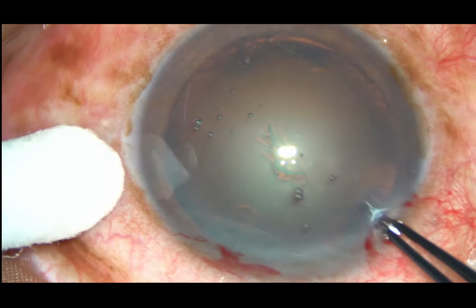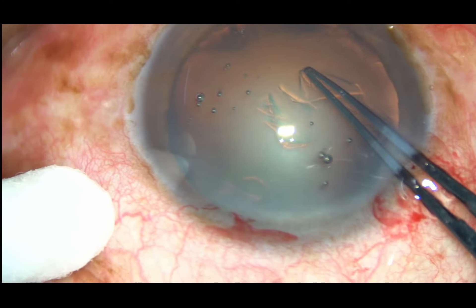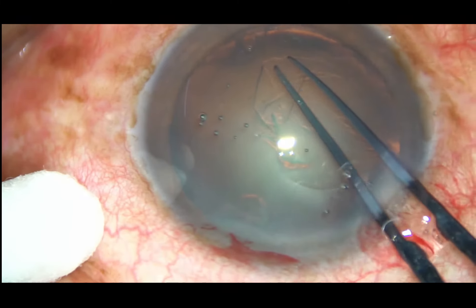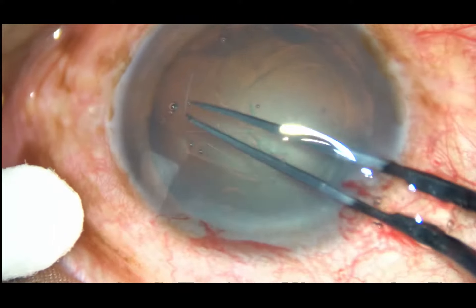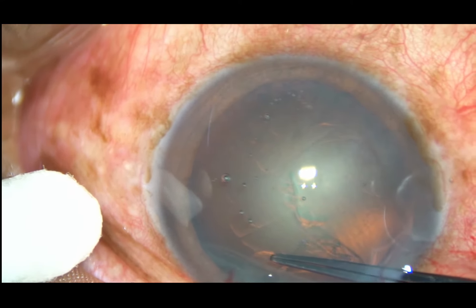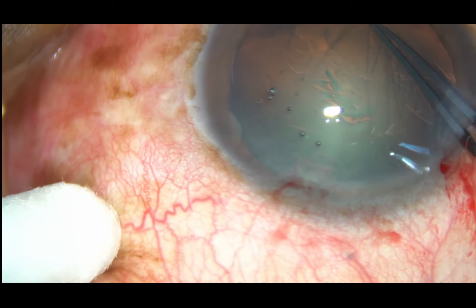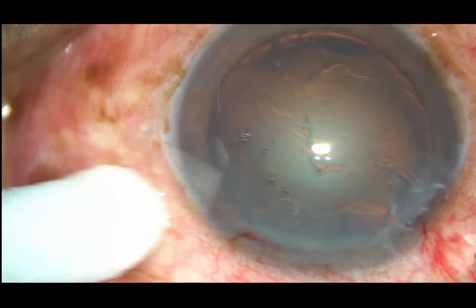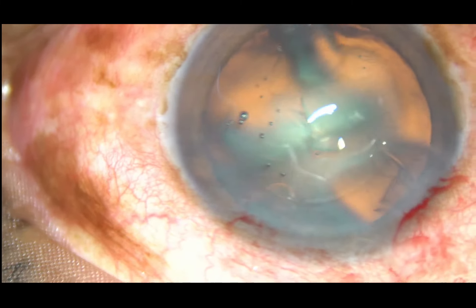Now I take utrata forceps, hold this capsular flap, go anti-clockwise and do a continuous curvilinear capsulorhexis. This is a very nice rhexis with controlled movement and almost circular.